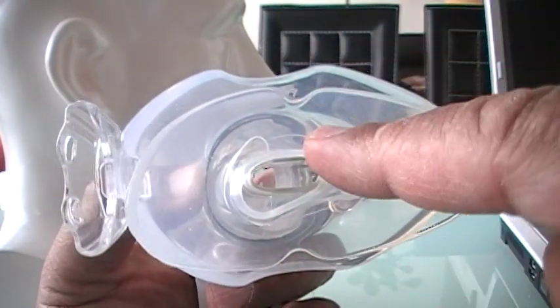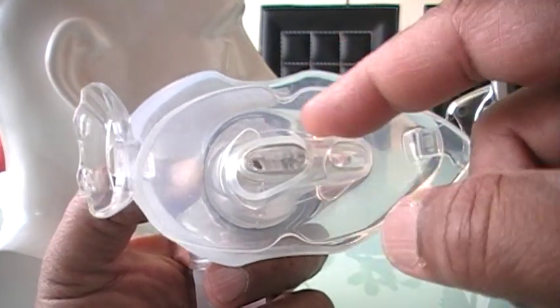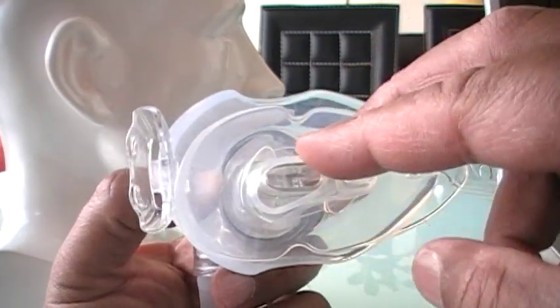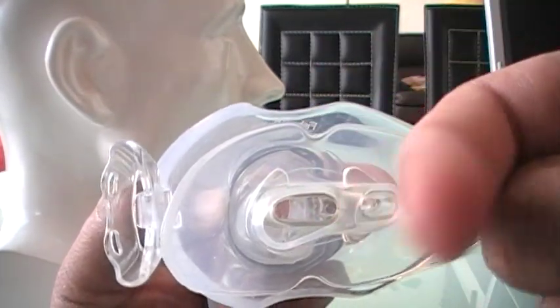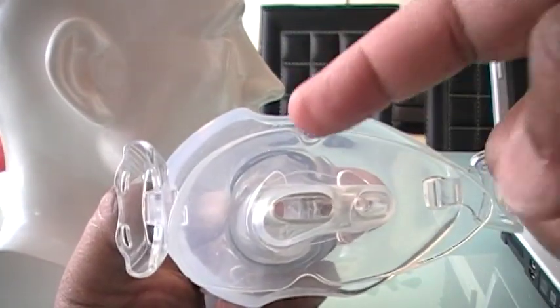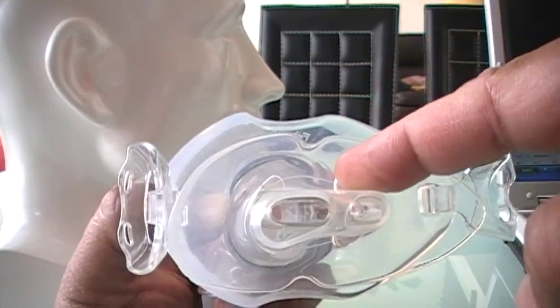A good number of people do gag on this. You know, when you go to the doctor's office and they put that little thing in your mouth — if you gag, you might be gagging on this. It doesn't stick all the way into your mouth, just a little bit — your teeth come up to here. This is the second edition. The older version came out more, and that's where a lot of the gagging took place.